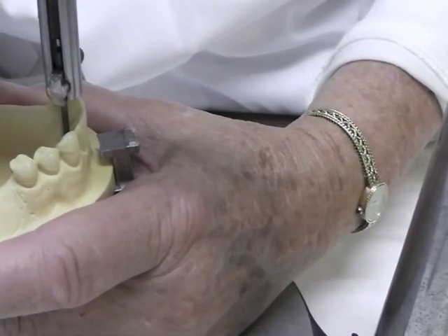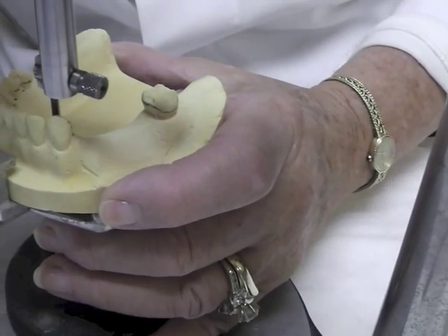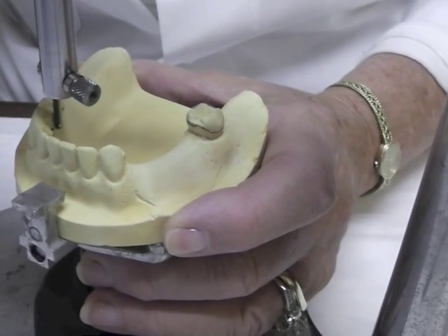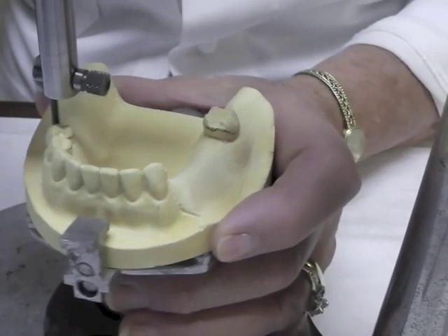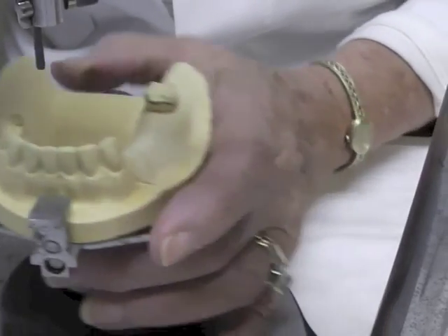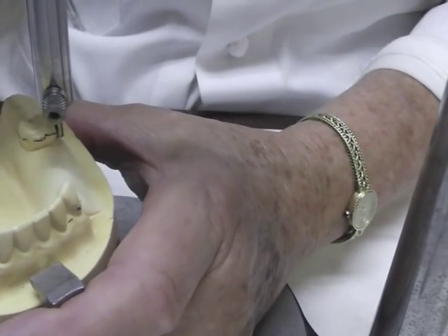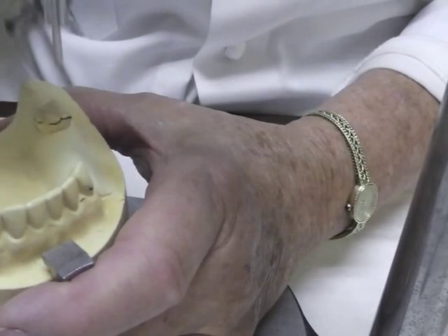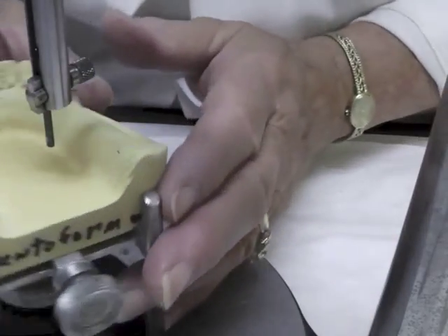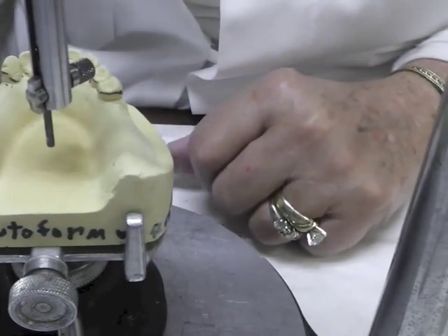We have to block out any undercuts that are on the cast. I'll survey all these teeth on the lingual. Now on these teeth next to the edentulous areas, I'm going to bring my survey around the buccal surface of them — I'll explain why in just a little bit. I'm going to come along the facial of this tooth too. I'm just getting three little marks at the end of the lead to roughly tripod that cast.